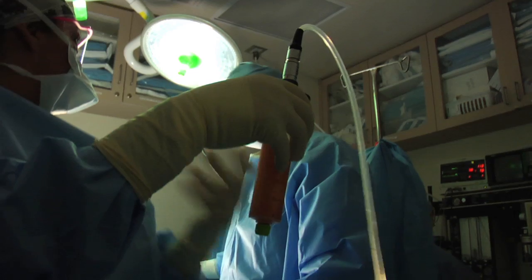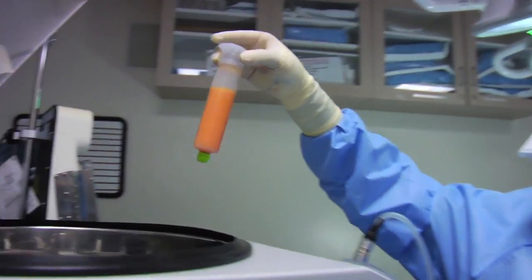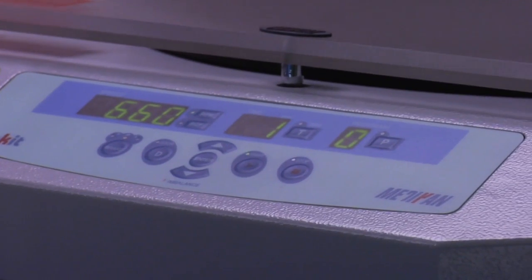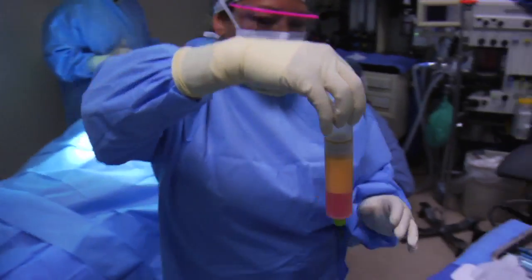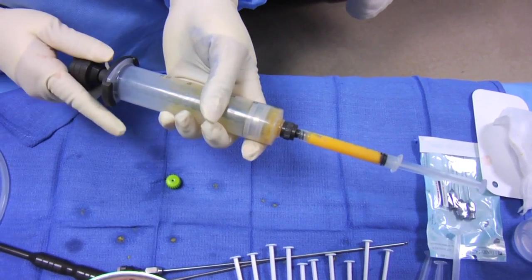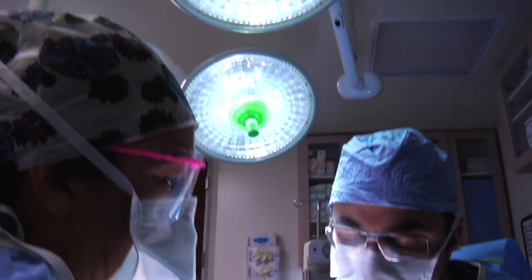now it takes it to an even lower level of chance of infection, as well as not exposing that fat to the air itself, so that it has the highest chance of survival in terms of fat grafting. It's a very purified product to transfer that's very clean and has a higher take in terms of survival of that graft into different areas of the face or body. To extract the fat while I'm doing liposculpture itself, for the fat transfer to her face.